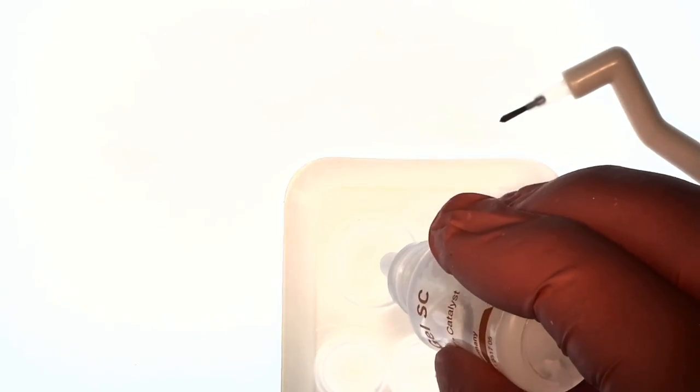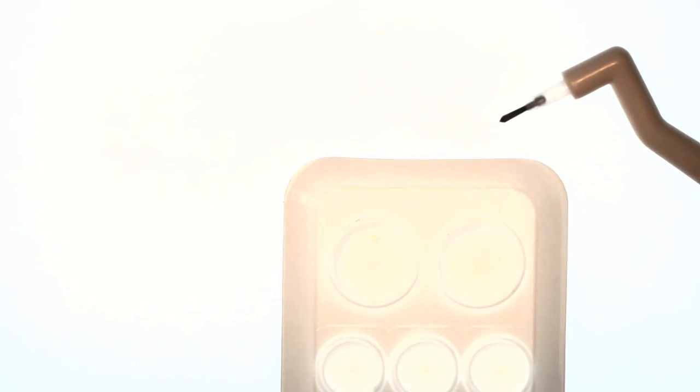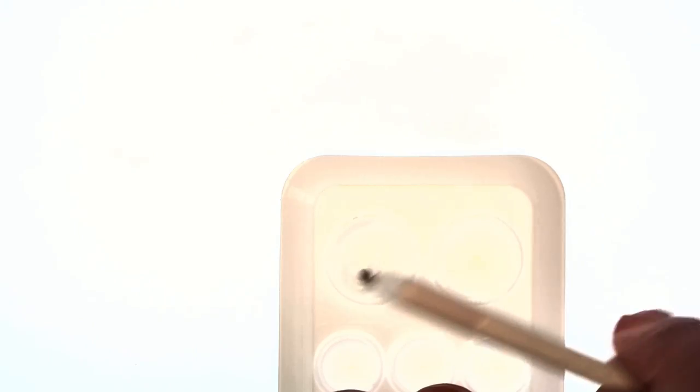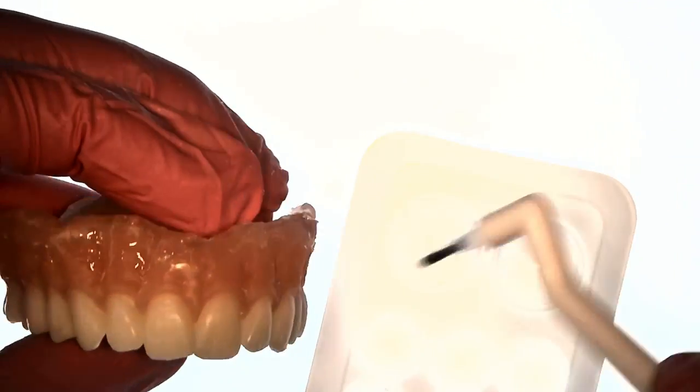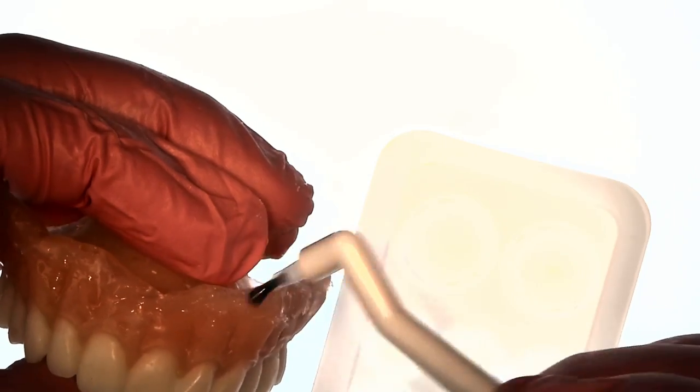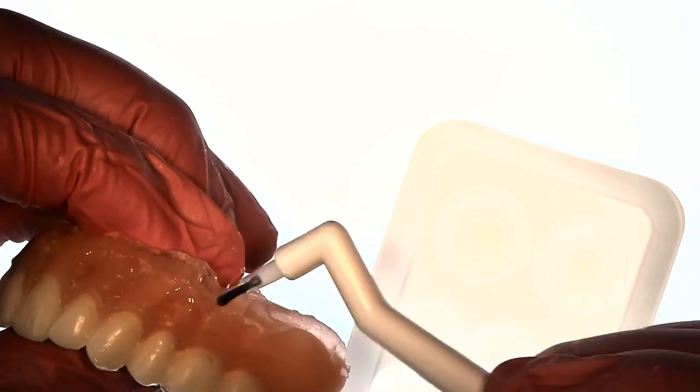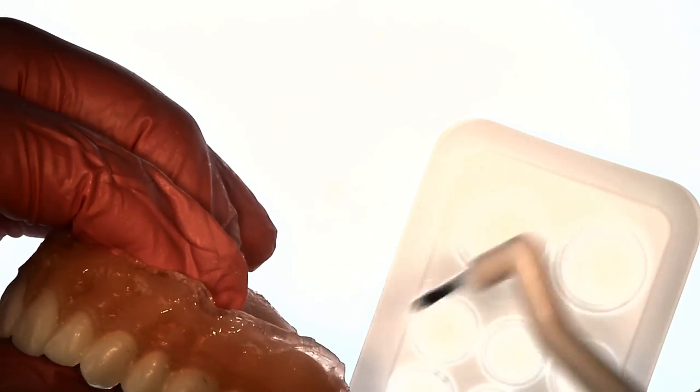The last step is to paint this sealer part one and part two, you mix it together and paint all the areas where the material meets the denture. You don't paint the inside of the denture at all. It's only the seams and this kind of melts those borders and fuses it permanently to the denture.